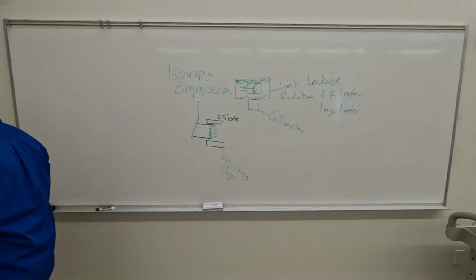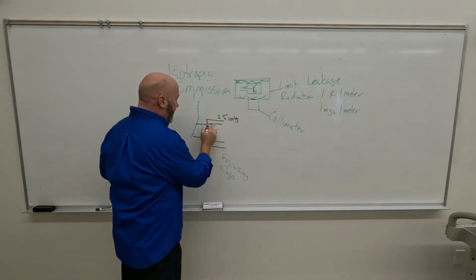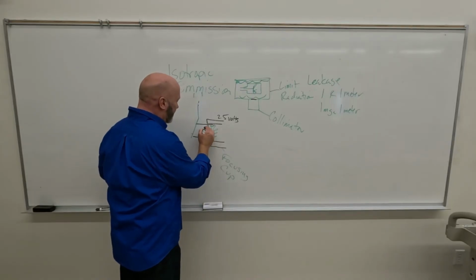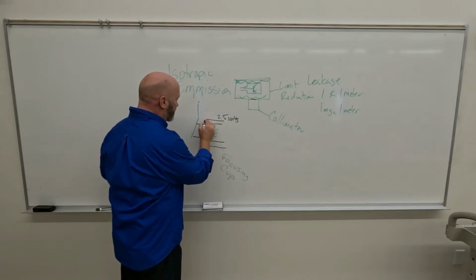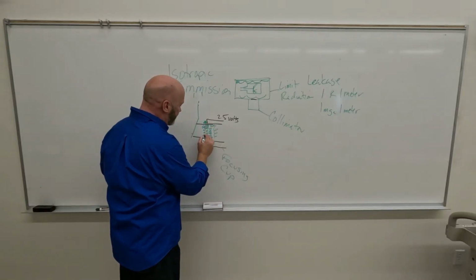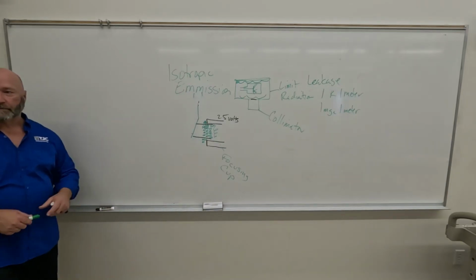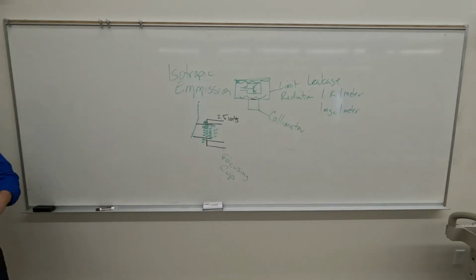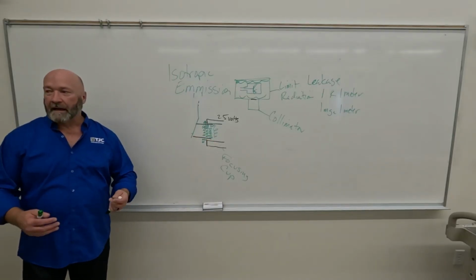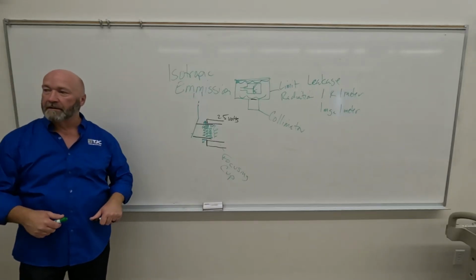But what if we put so many electrons around this? Keep color coding, right? What if we use very high MA and we put a tremendous number of electrons on this so that our electron cloud is massive? And then I send them across the tube. Some of them are out past the focusing cup. What's going to happen to my sharpness of recorded detail? Yeah, it's going to decrease.